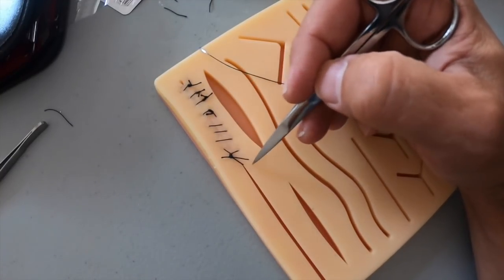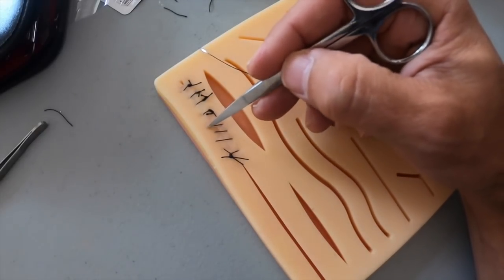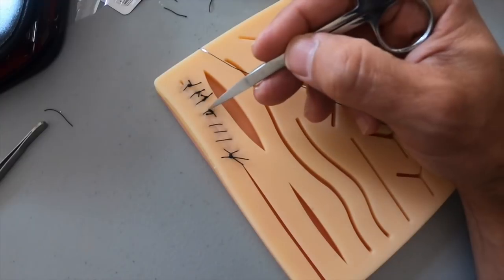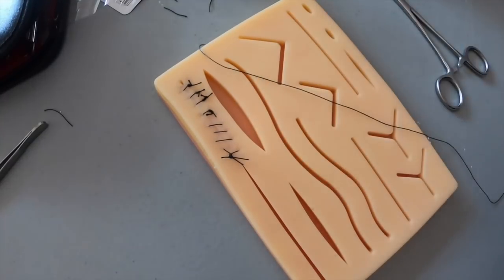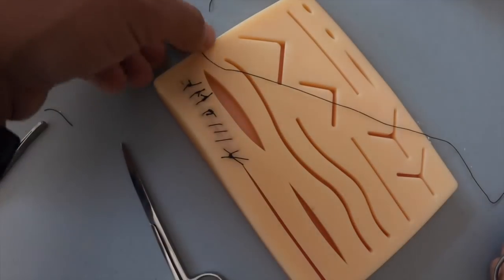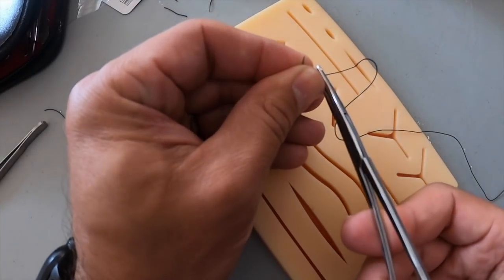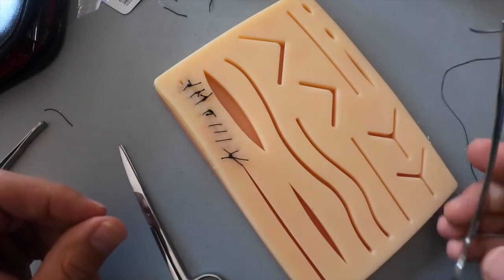It helps stop the bleeding and it ends up with a stitch that looks very nice and tidy. What it does is pull the tissue together this way and this way, so it really helps with bleeding wounds like in the scalp, places where there's tension and things like that. So let's go ahead and get started.